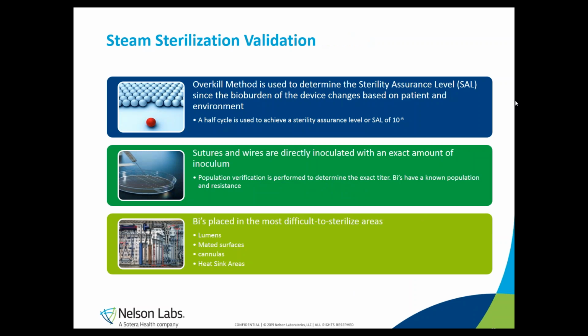The overkill method is preferred because the bioburden is not always the same. The bioburden of the device is different for various patients and environments.